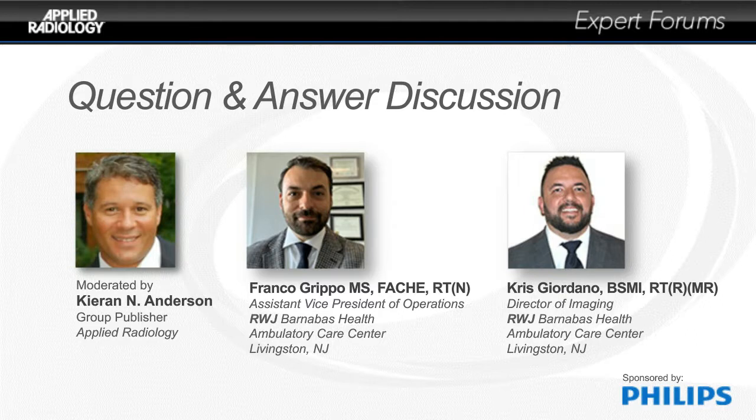We have found that to be the case, with a little asterisk caveat: as long as our system works as intended. If the scheduling coordinator is getting that implant information at the time of the appointment and delivering it into the scheduling work list, so that our technical staff can obtain that documentation, then yes, we can easily facilitate that. We have our set base of protocols already set up, where the radiologist would not need to okay each particular limitation that we're setting.